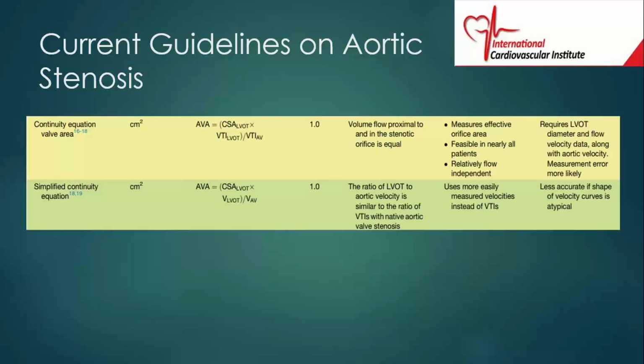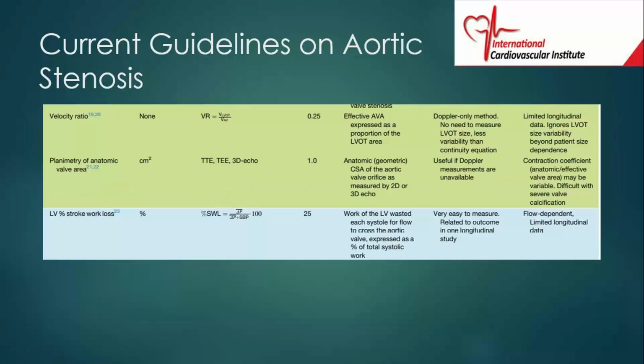So when you just measure a velocity, you don't look at the curve at all. You just measure the velocity, and that's not totally accurate, but you can use it. But the continuity equation is really the VTI.